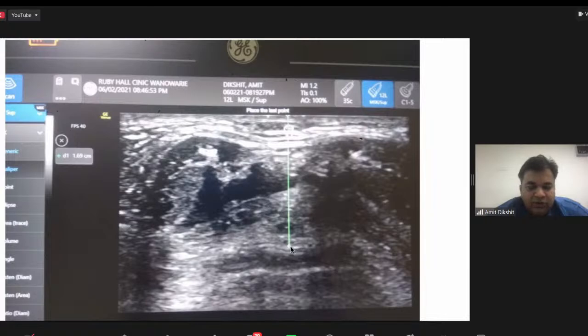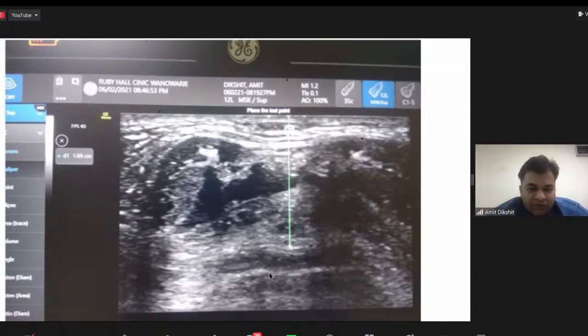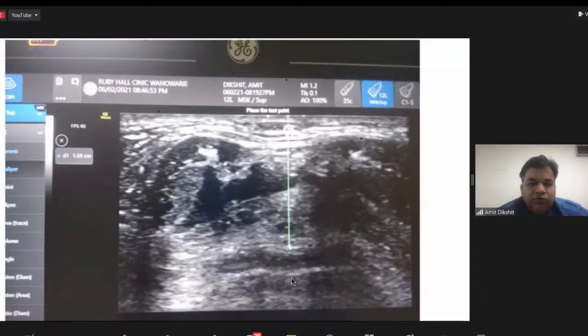Instead of placing the cursor up to here, probably the air mucosal interface, the white line, is where people say we should be calculating from, the base, right down there. Now most of the articles say mid epiglottis. Even some of them, instead of using a transverse scan, are using a parasagittal scan.